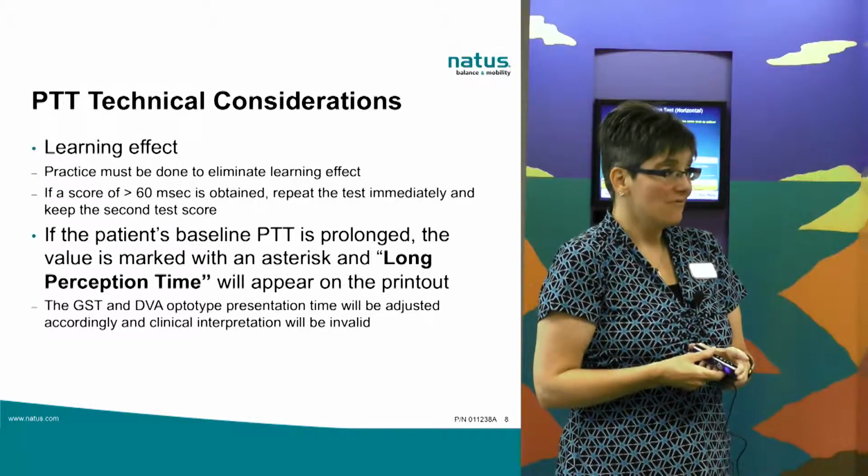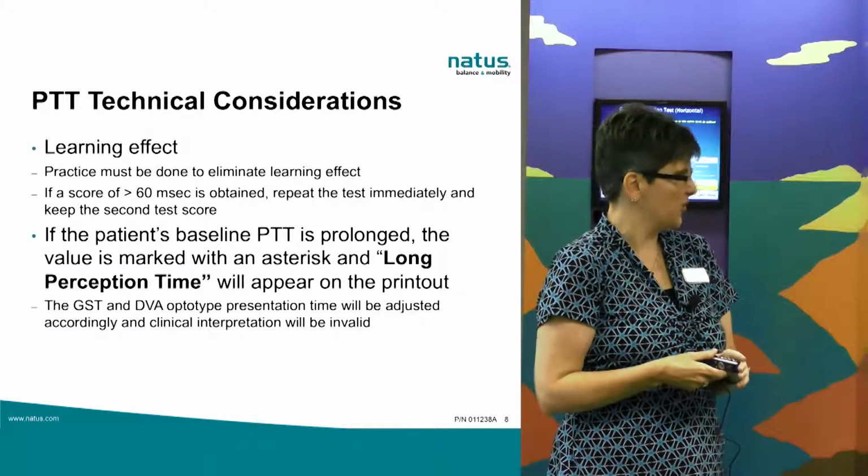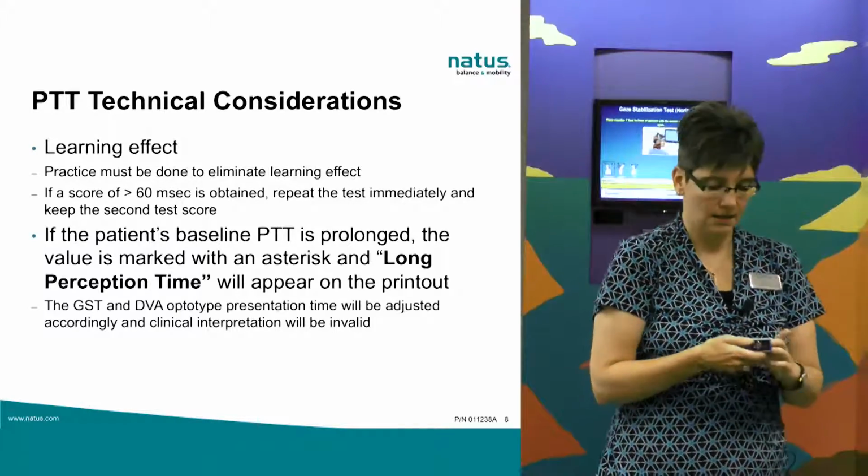There is a learning effect to all these tests. So if your patient scores abnormally the first time you do perception time, give them another chance at it. See if they can do it the second time through.